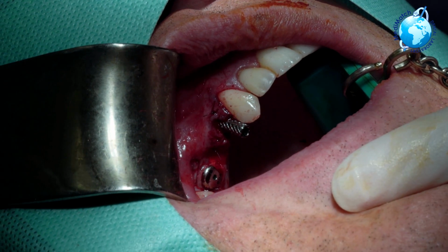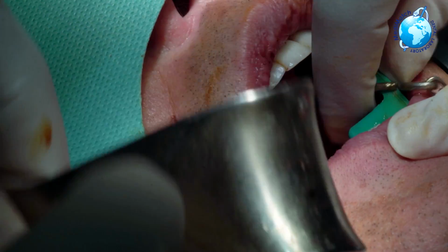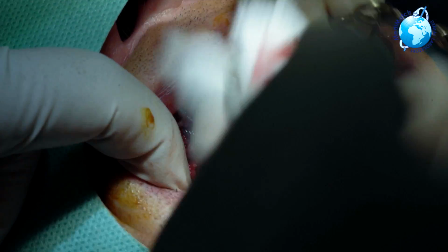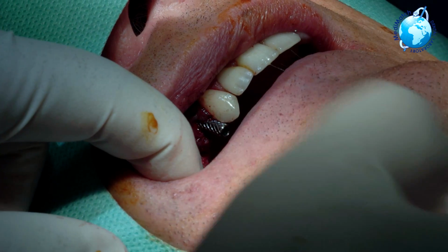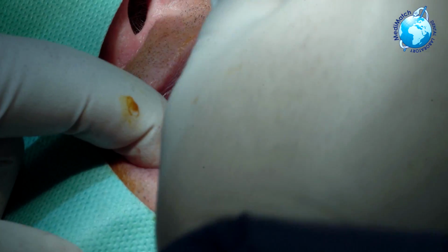All done. Okay, so Alan, that side's all done. Your sinus lift is all done. Very happy with that. And that's going to come out. Right, and bite together for me, sir. Good. Open. I'll move that out of the way, but I want you to bite on this gauze for the minute, okay? Open wide. Great. And bite.